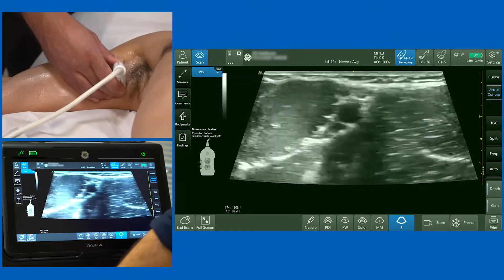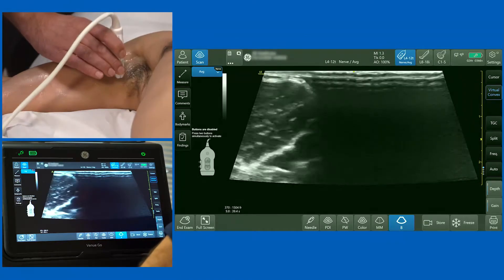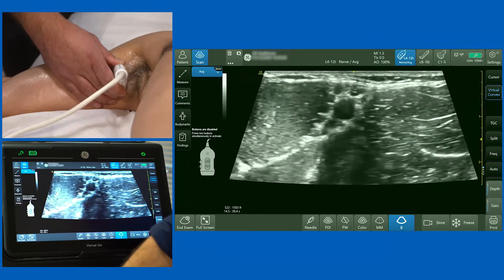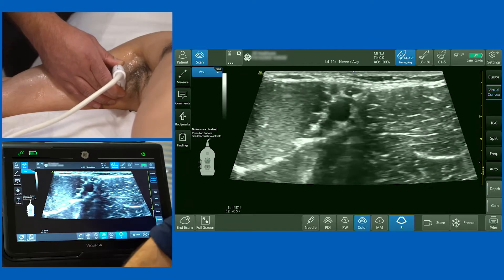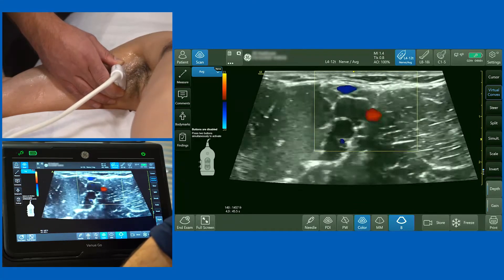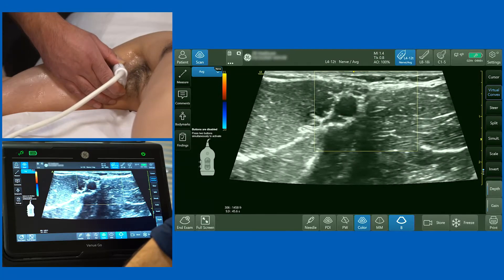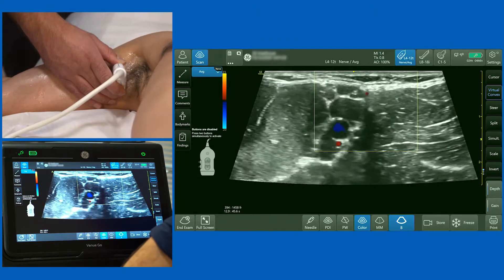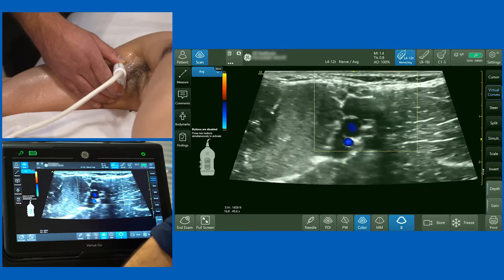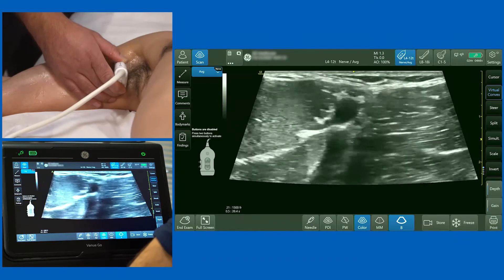Having placed the probe in the axilla, the left-hand side of the screen is lateral and the right-hand side is medial. The first thing I want to do is identify the axillary artery. Using color Doppler, you'll see a pulsatile structure. As I release the pressure, the veins appear — and in this model's case it looks like there are at least three axillary veins.